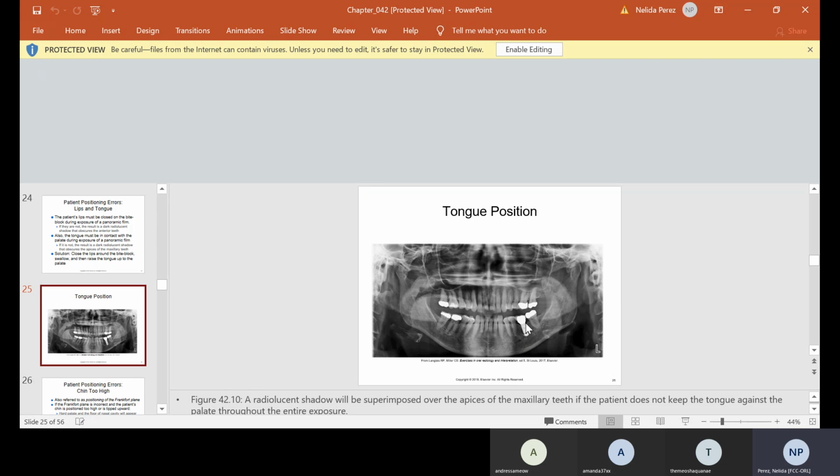I want you guys to see this. A lot of you guys were confused before. If you see my arrow, there were some panels that I showed you before, and some of you guys said that that was an implant and it was root canals. An implant actually looks like this one right here where my arrow is. So there's the difference, okay? It looks like a screw, okay? And then, of course, we talked about these, all right? Crowns on the teeth, and we have some fillings on the teeth, okay?